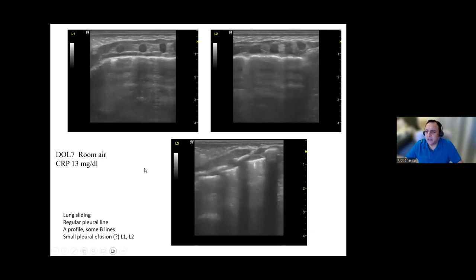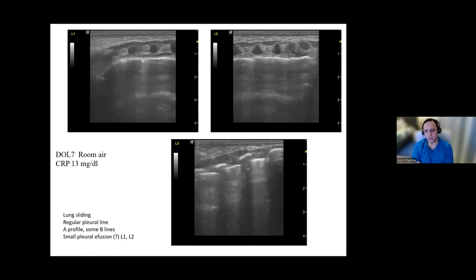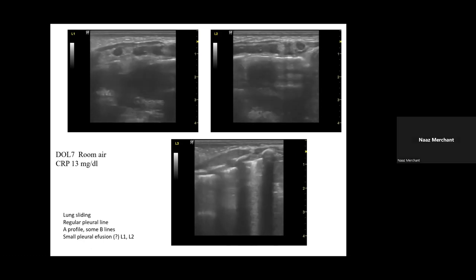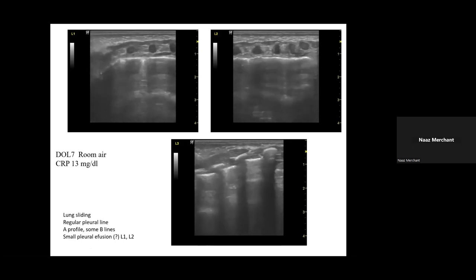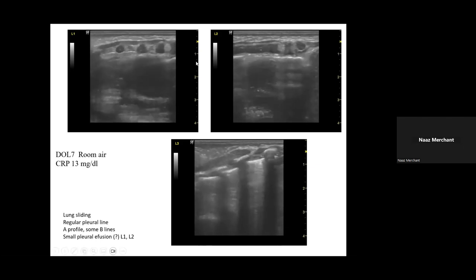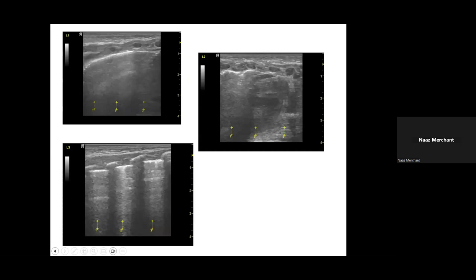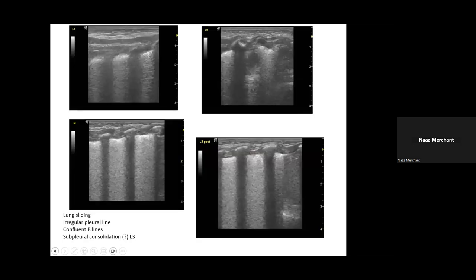So I was going to ask Naz, what's your clinical feel on this baby? You're thinking of a diagnostic kind of approach. We're just going to mental model. So the initial scans, the first ones, which Anna showed, looked more like an RDS kind of picture with good pleural sliding, mainly a B profile. And if you did a BRAT score, I guess it would come to two on each of the right side, left side, and the axilla. So it would score, and I don't think surfactant was given, but clinically and on the ultrasound it possibly fit criteria to think about giving surfactant as well.